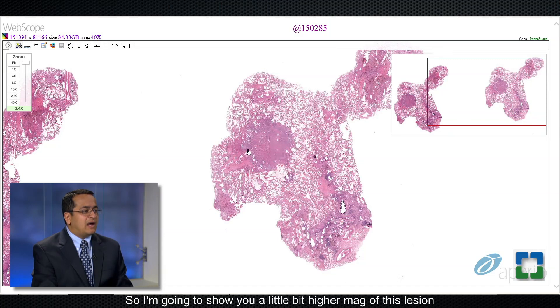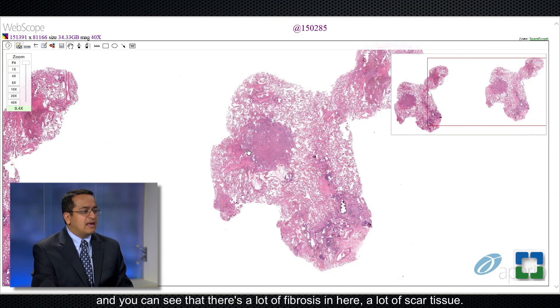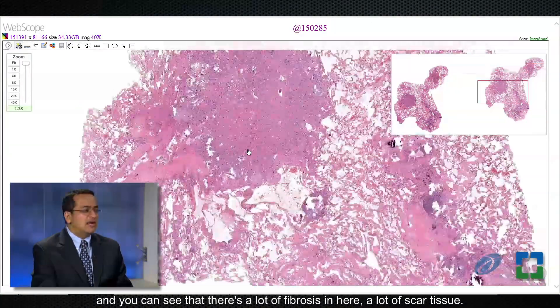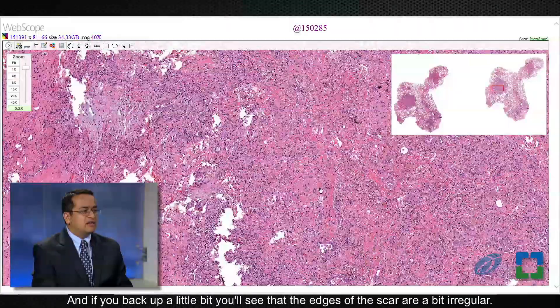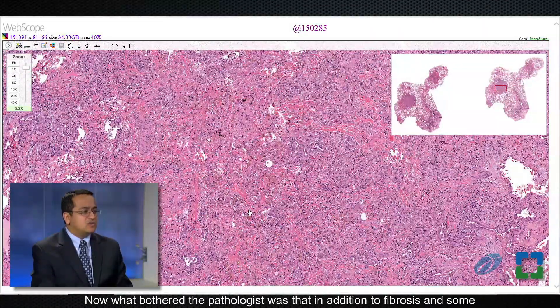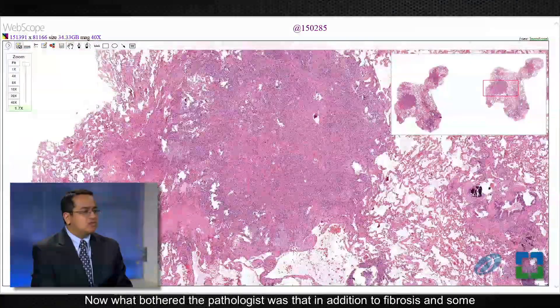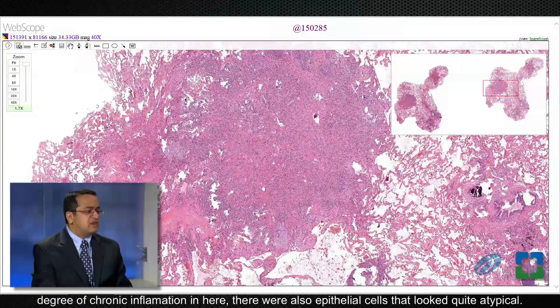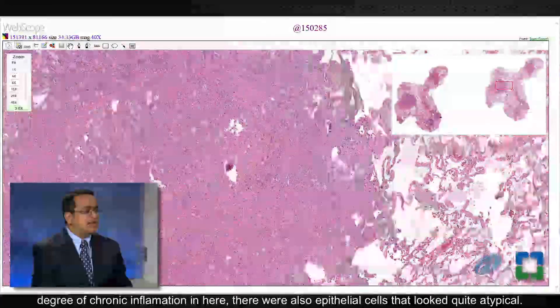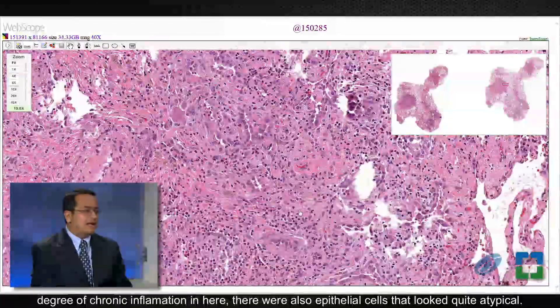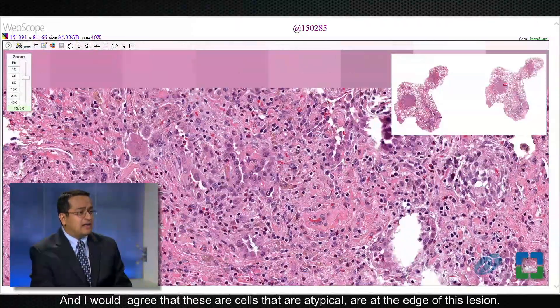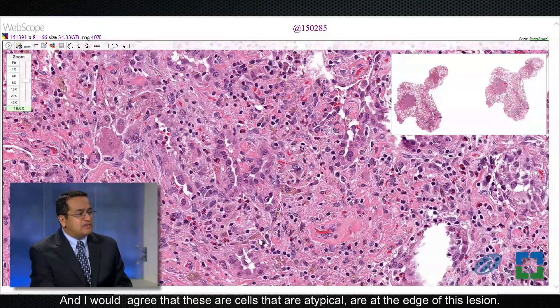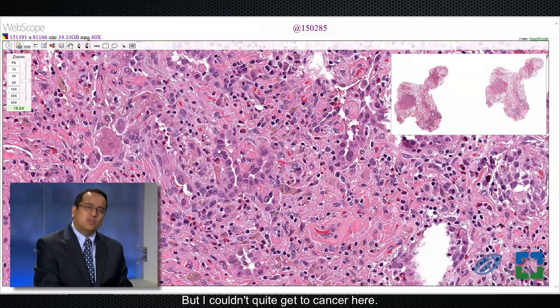At a little higher magnification of this lesion you can see that there's a lot of fibrosis, a lot of scar tissue, and if you back up a little bit you'll see that the edges of the scar are a bit irregular. What bothered the pathologist was that in addition to fibrosis and some degree of chronic inflammation, there were also epithelial cells that looked quite atypical. I will agree that these atypical cells are at the edge of this lesion, but I couldn't quite get to cancer here.